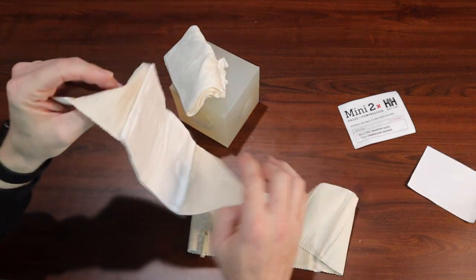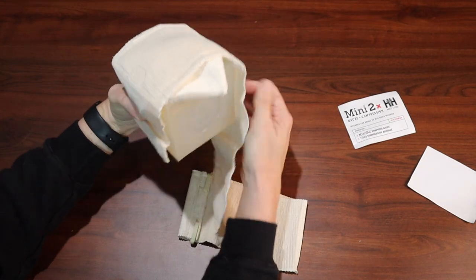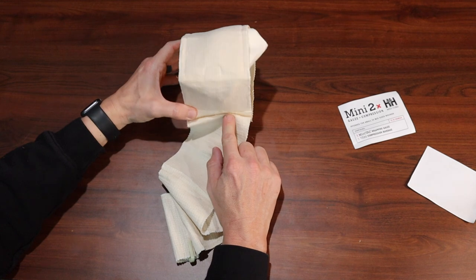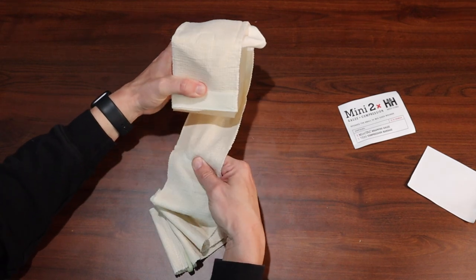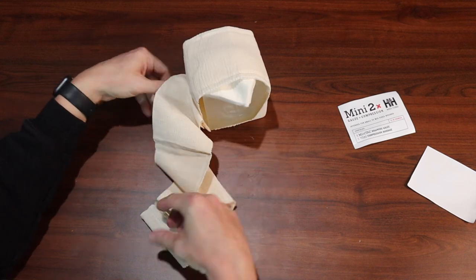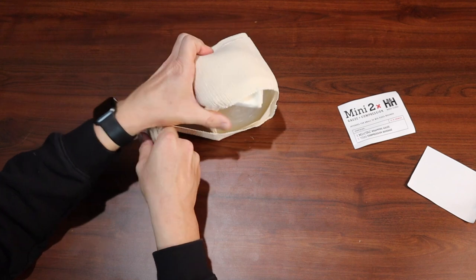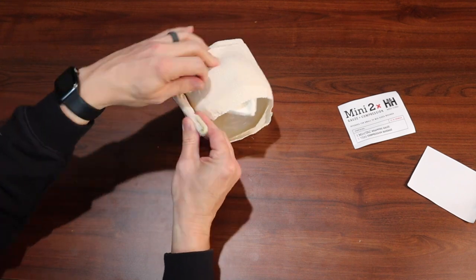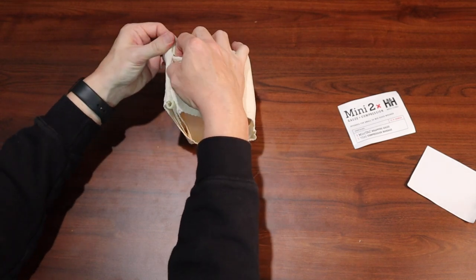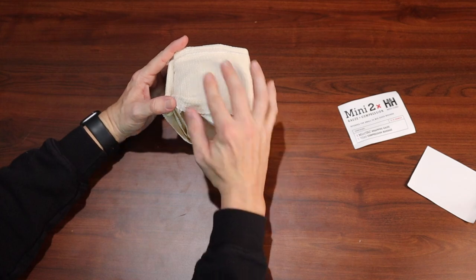Then we take our pressure bandage and wrap it around. We have Velcro here on this side that, once you make that first loop around, is going to help hold it in place. Wrap it around, and then once you're done, use the clip to hold it in place. Then monitor it to make sure it doesn't bleed through.